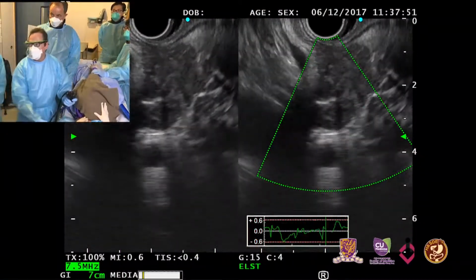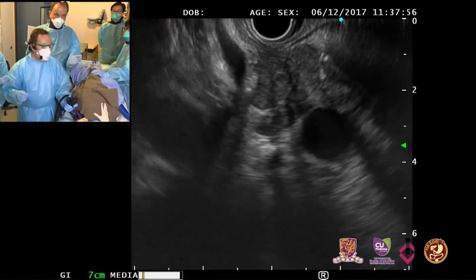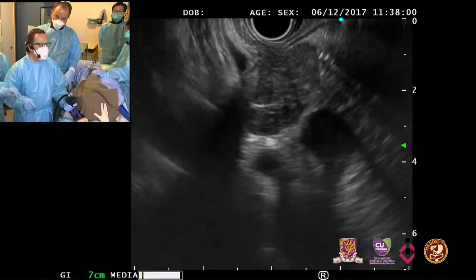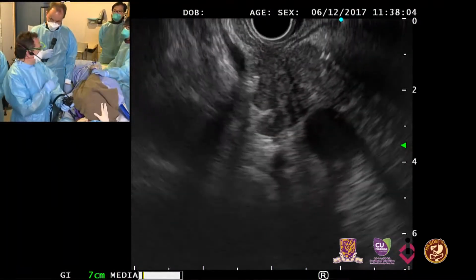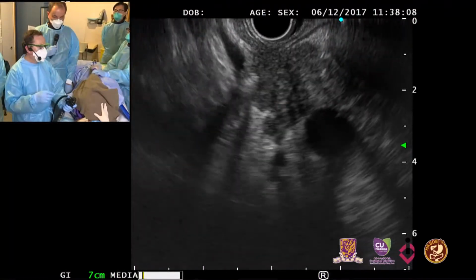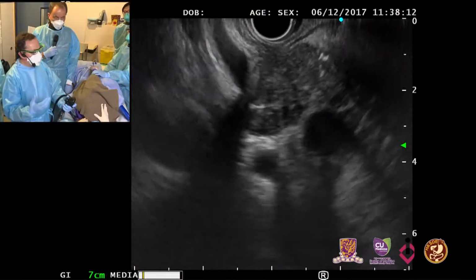Can we go back to normal function? Does it help you to target the area? Would you prefer to puncture one of the softer parts or the harder parts? Well, some people make the argument that it helps you select the best area for the lymph node. I am not such a big believer, but you could make the point.